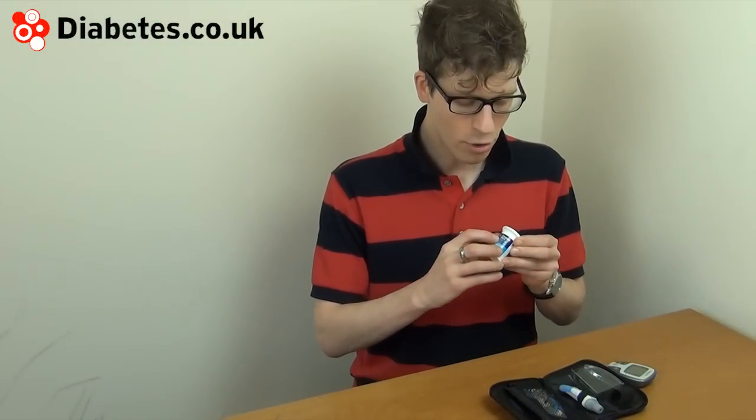The test strips used by the Contour XT are Contour Next test strips. These are new as of 2012 and are different to the test strips used for Bayer's previous meters such as the Contour, Contour Link, and Contour USB.